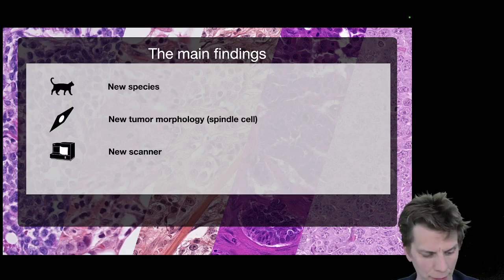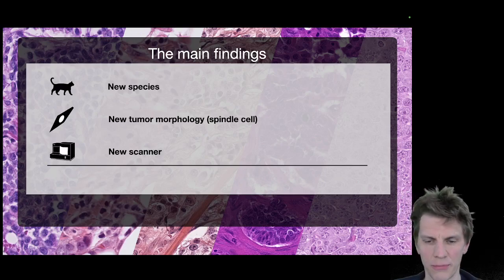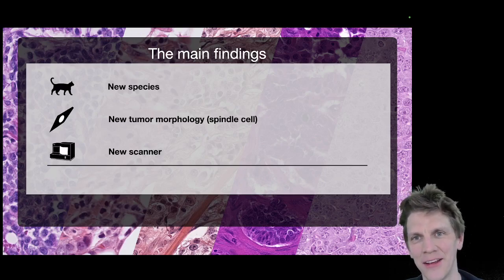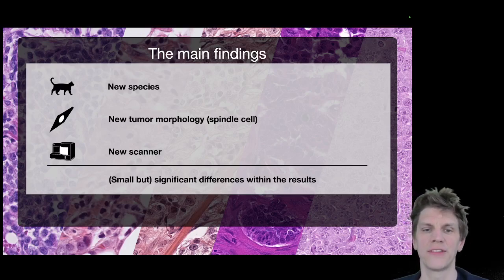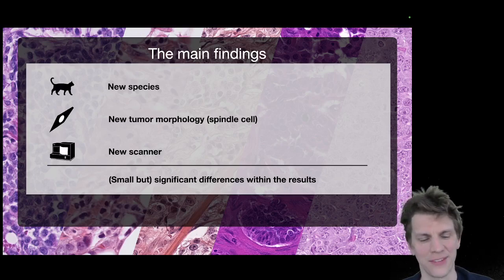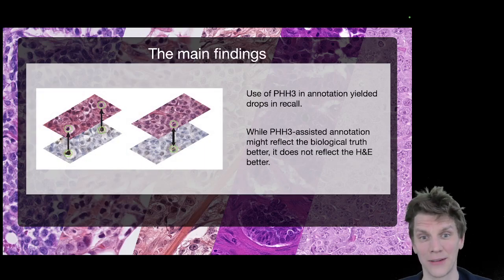For all of those, we found that if we consider those individual ingredients to a domain statistically, then we find partially small but certainly significant differences within the results. So that was quite interesting. Even though we had quite okayish results, we still had this domain dependency across our teams in the results. Yeah, and what else? Well, I already kind of teased you a little bit here.